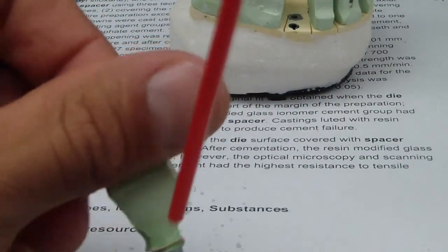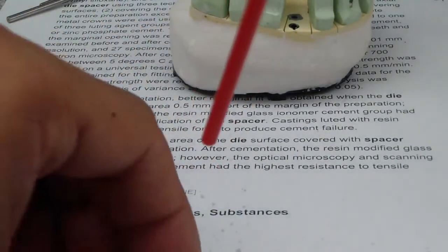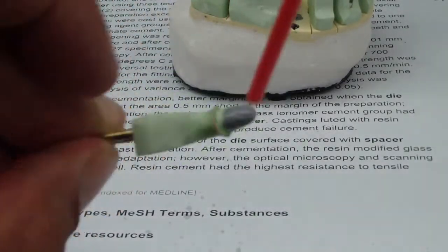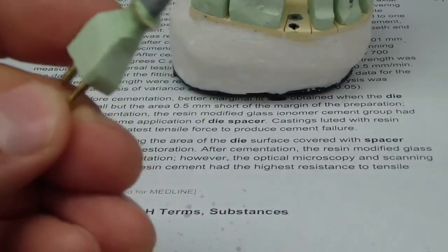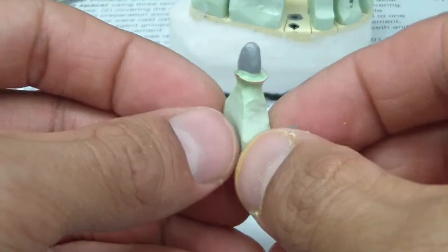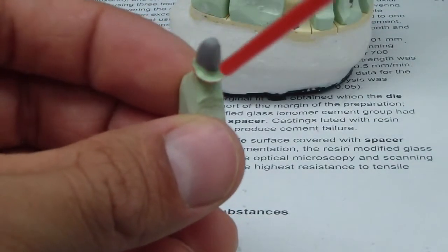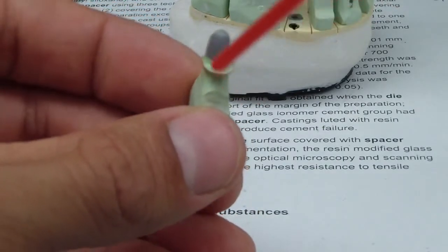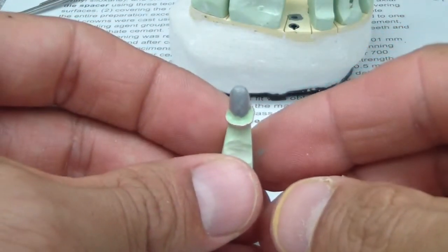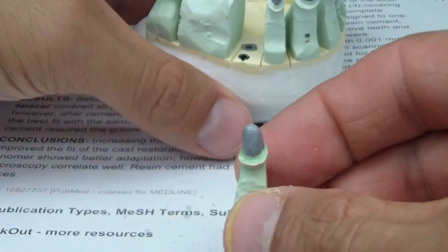Of course there are variations on how to do this. So there we have it — we're going to go and complete the remaining dies, just making sure there's no gooey material around the margin. So that's one more step in the process of wrapping up this case. Cheers.